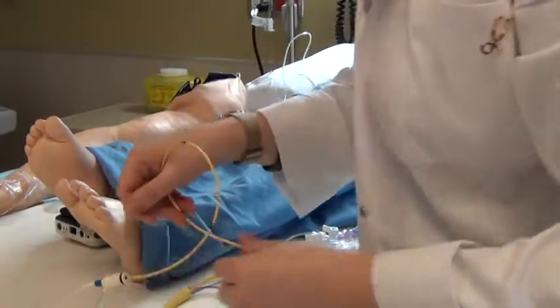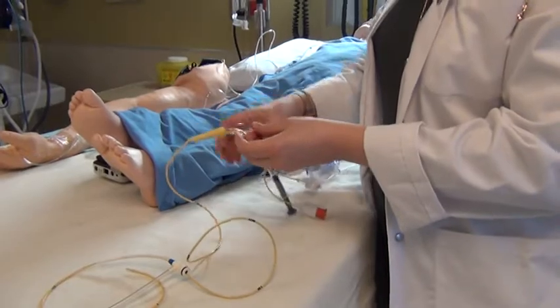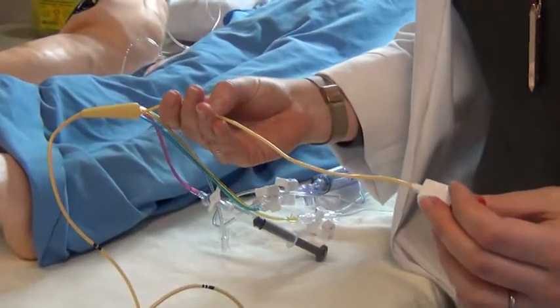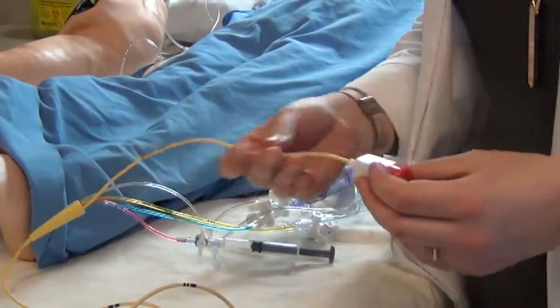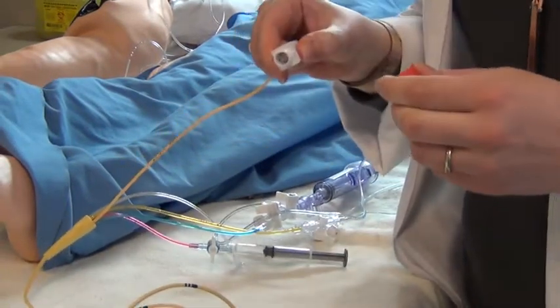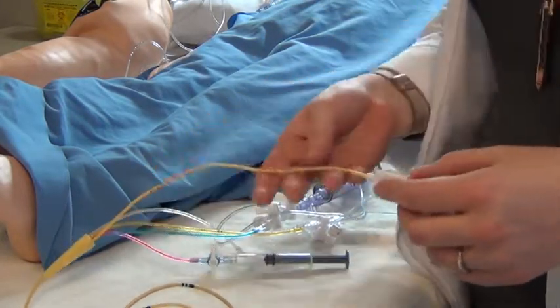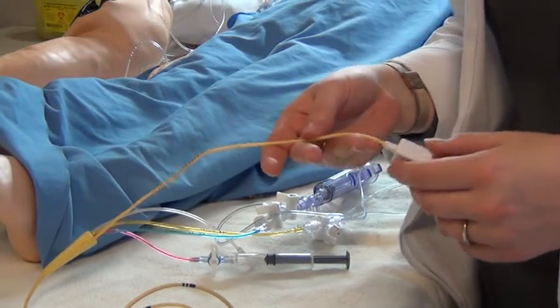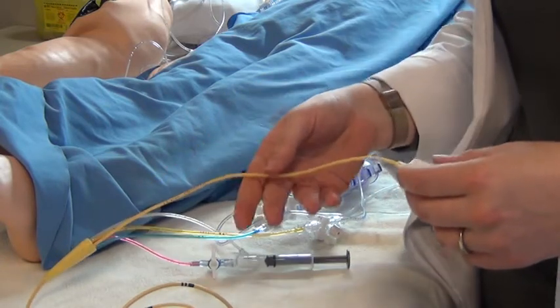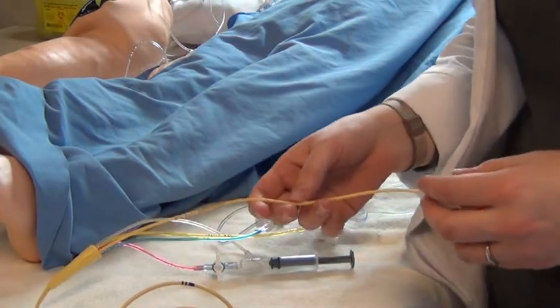The pulmonary artery catheter has essentially five different lumens. The first one is called the thermodilution catheter or thermodilution line. When opened, it connects to our cardiac monitor, and through an algorithm the monitor receives the different values and provides hemodynamic parameters like cardiac output. The way this catheter works is through thermodilution, which we'll discuss further when we talk about cardiac output.